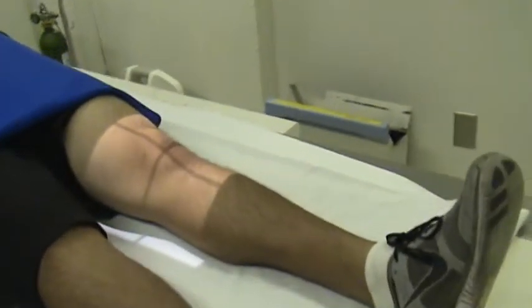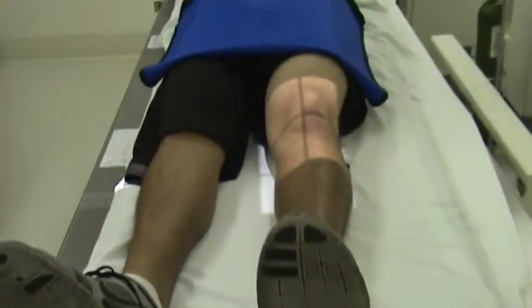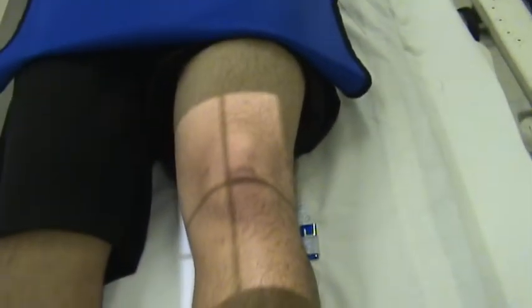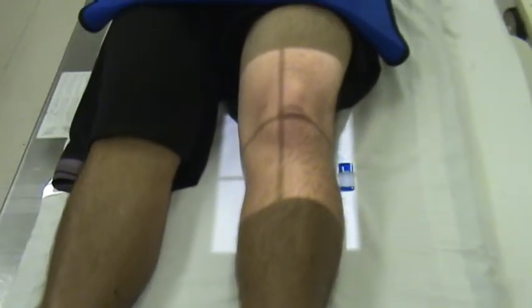You want to make sure that there is no rotation of the body part and that you are centered right at the mid-sagittal plane of the knee. Perfect. You also want to make sure you collimate down to only the parts that you need. This will help reduce unnecessary patient exposure and will give you the best contrast that you can have. Include your marker in your collimated field and make sure that it is anatomically correct, as this is a left knee. Our center ray will enter 1/2 inch below the patellar apex.